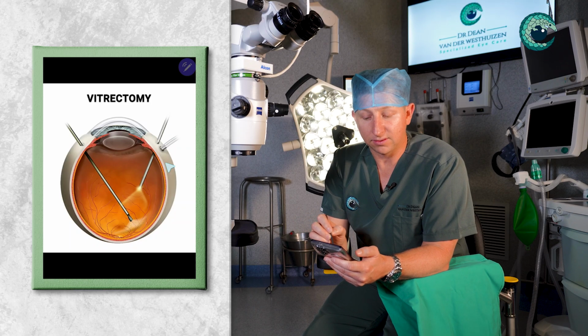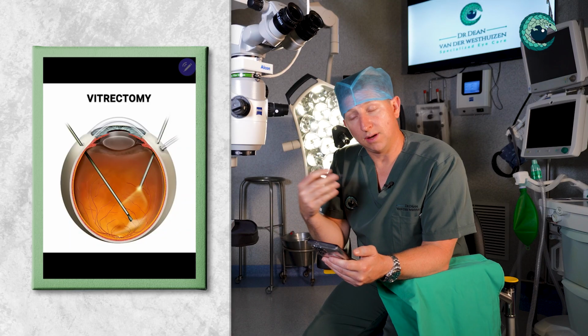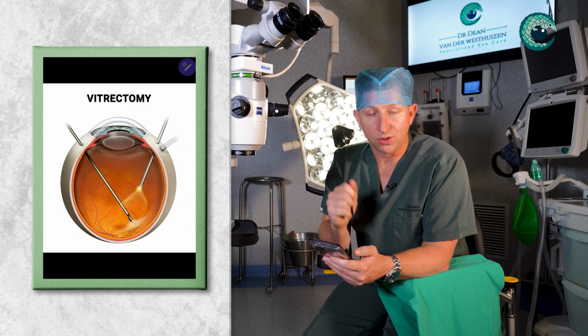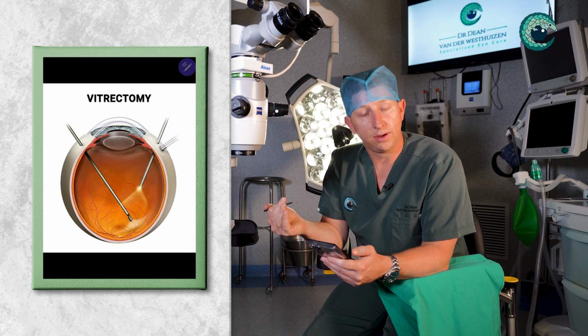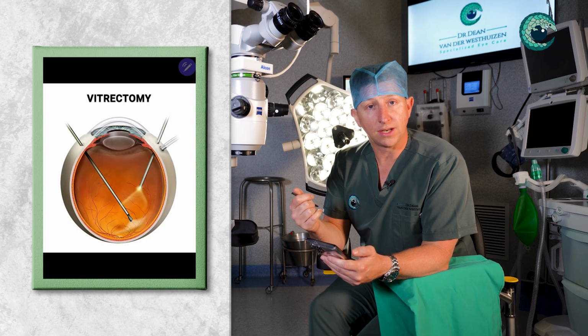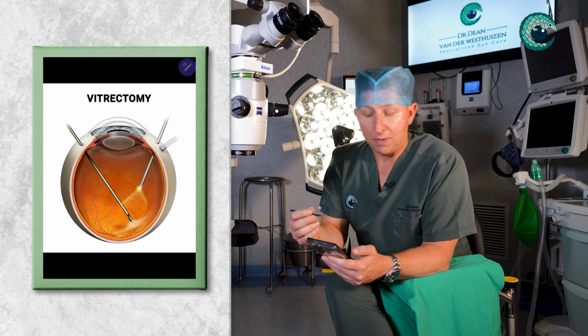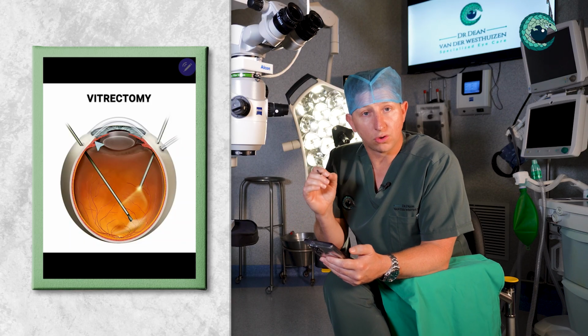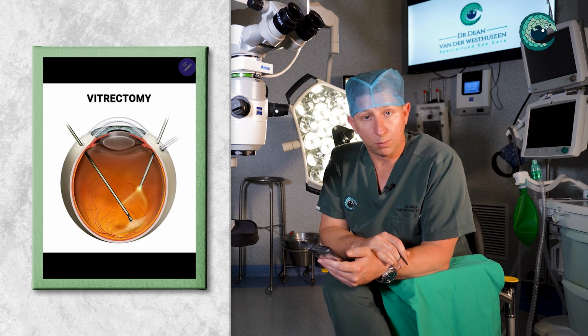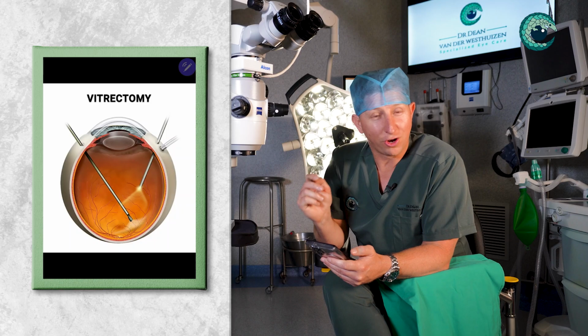Normally we place something in the eye as a tamponade: air, special gases, oil, and then occasionally we may put in small sutures, or the wounds may be self-sealing. If they seal themselves, that's great. Occasionally, if they don't seal, one may need to put a suture just to close those holes. So at the end of the case, the only real incisions you've had are these 3 ports that are placed in the pars plana region.